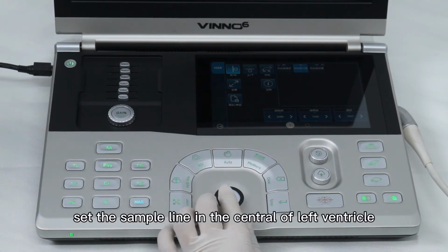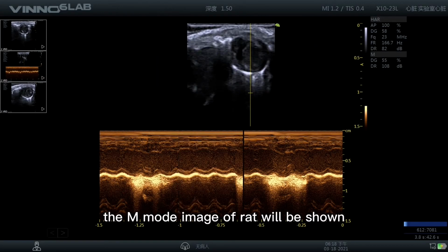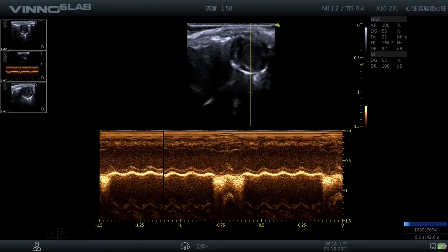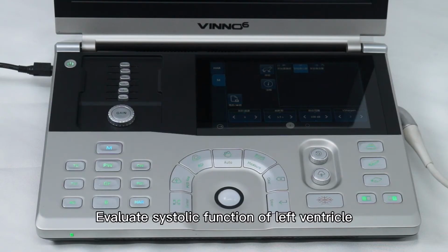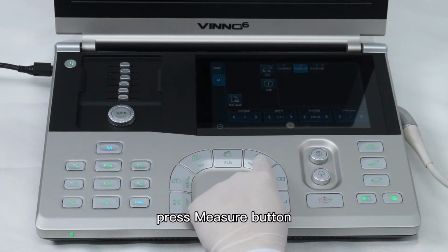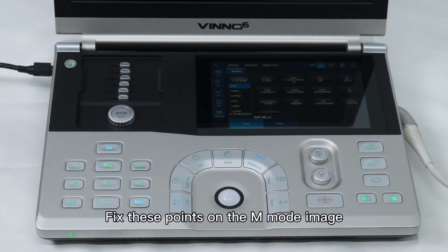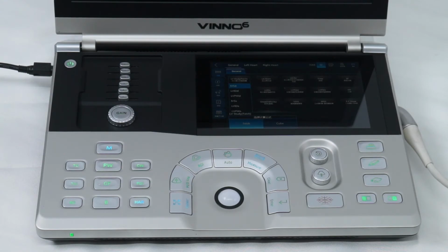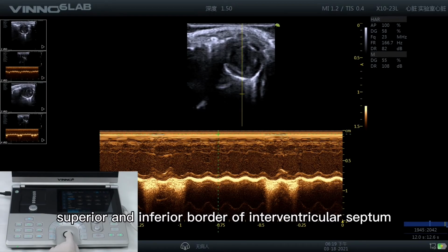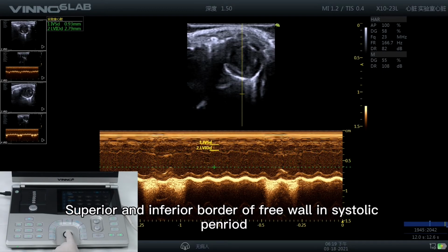Set the sample line in the center of left ventricle. The M mode image of the rat will be shown. Evaluate systolic function of left ventricle in the M mode image. Press Measure button. LV study is set as the default item. Fix these points on the M mode image. Superior and inferior border of interventricular septum. Superior and inferior border of free wall in systolic period.